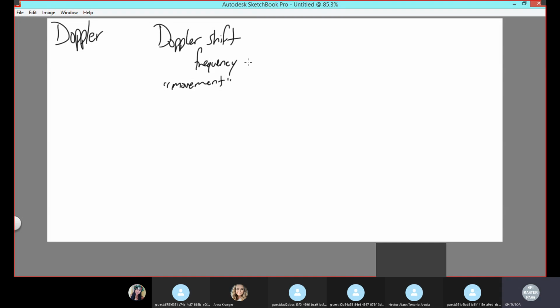All right. We use it for blood, but the machine just says, if it's moving, I'm putting color on it. That's why sometimes you see color in really weird places, and you know that there's no blood there. So why do I see color? Because we assume if there's color, there's blood. That's what we assume. But no, the machine says if it's moving, I'm putting color on it. So I just want you to know that. It's a movement for the Doppler shift. Now the concept is things moving together or things going apart. Moving towards me or moving away from me.